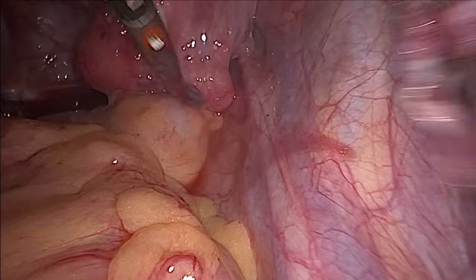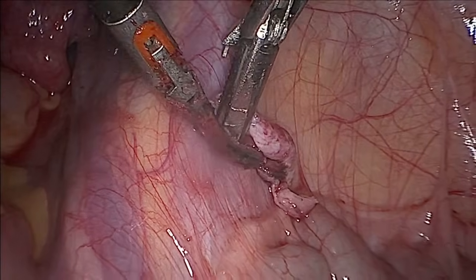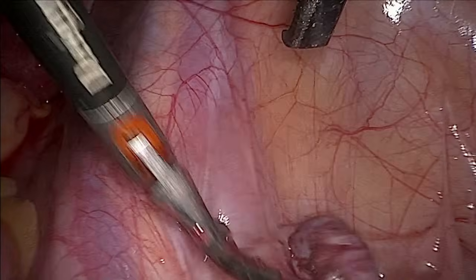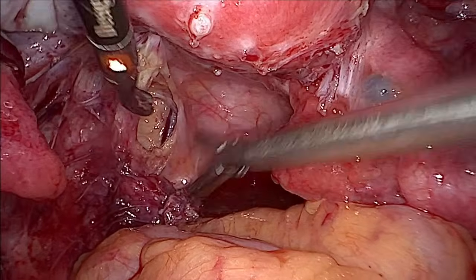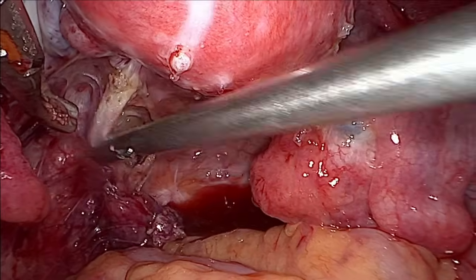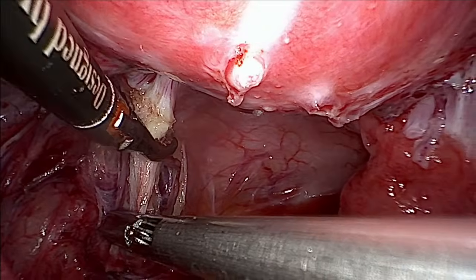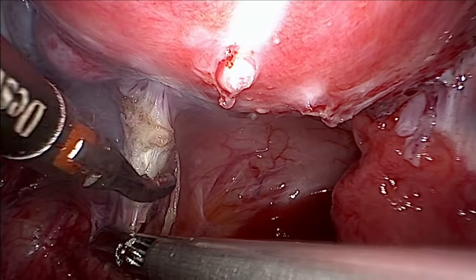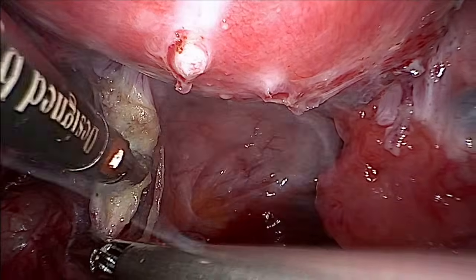You can just park it here. The uterosacral looks okay, but we can see the fibrosis here.